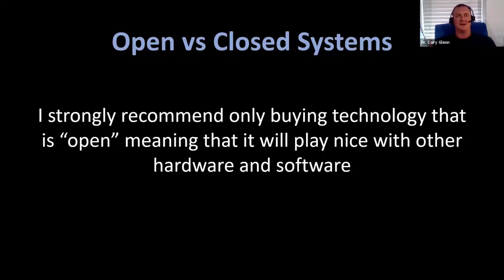as you get into this, you're obviously going to have a few things to be able to get started. You're going to have some way of generating models, right? If you're going to do printing, you're going to have some kind of printer. If you're going to do sintering, you've got to have some kind of oven. Okay, so there's all these components that come together if you're going to make these restorations in-house.